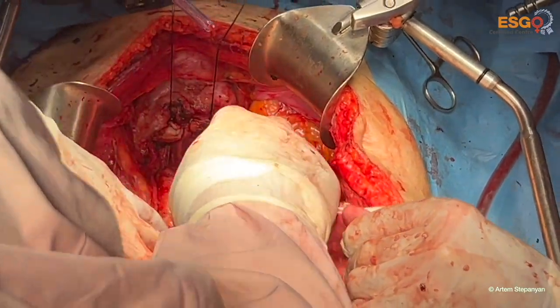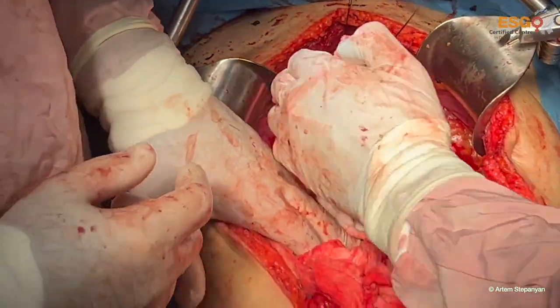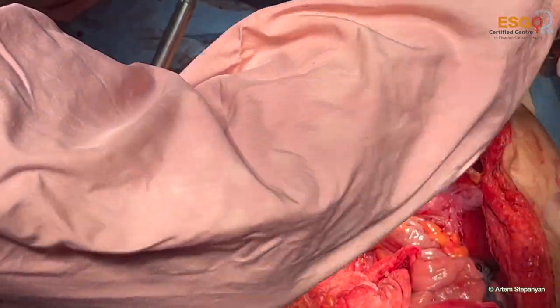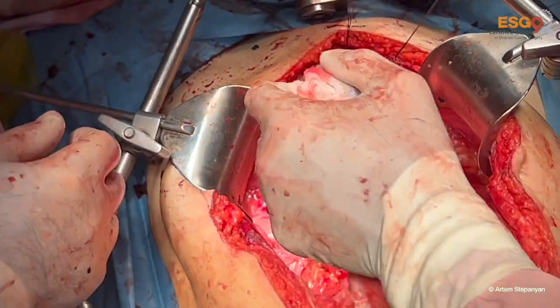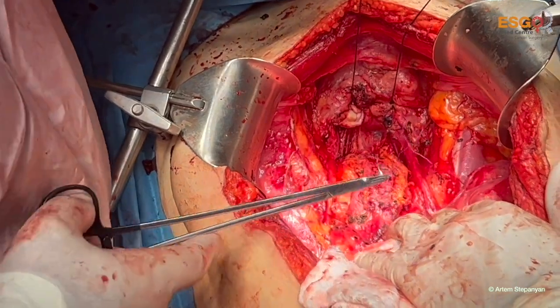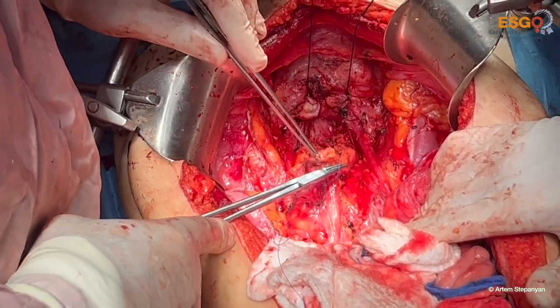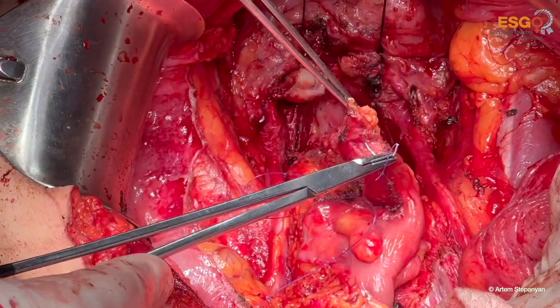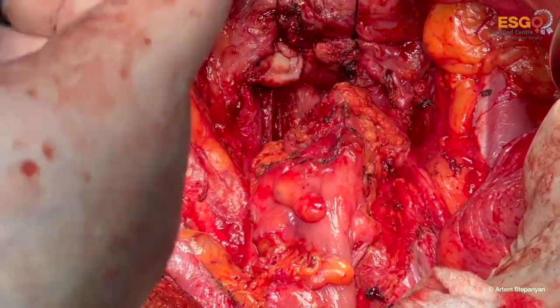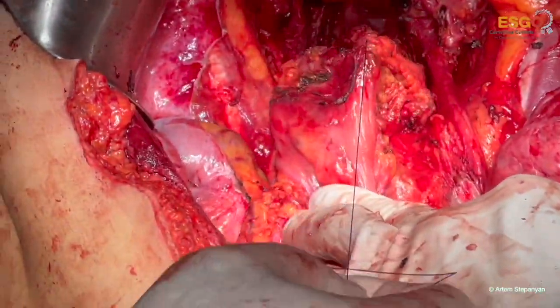Okay. Looks like we were able to achieve complete gross resection in this case. It is important in this patient because she has a low grade tumor and the expectations from the surgery are very high. And it was very, very important in this lady to achieve complete gross resection.